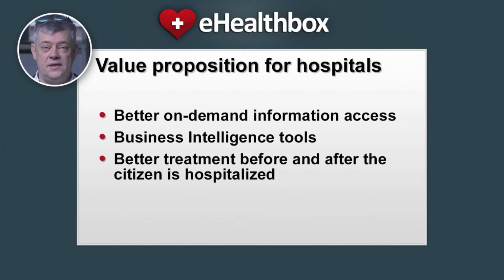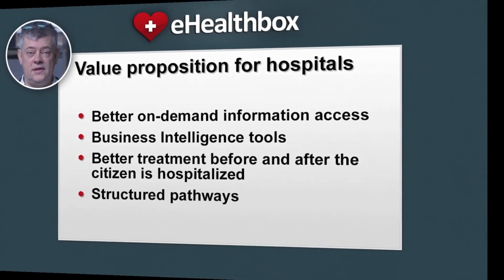The eHealth box offers better treatment before and after the citizen is hospitalized, because the doctor has easy access to the citizen's health data and can therefore better prepare the treatment. Finally, structured pathways give the doctor a standardized and structured pathway to add data and results about the citizen's chronic disease.